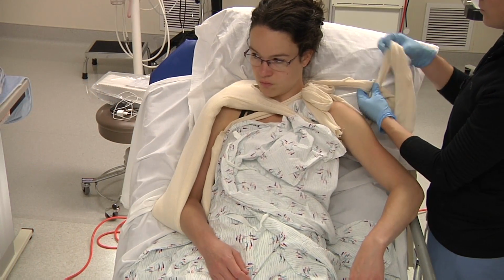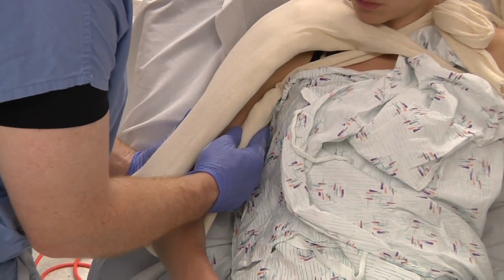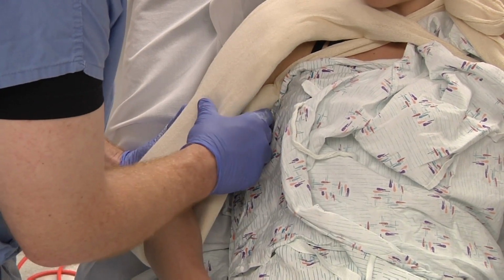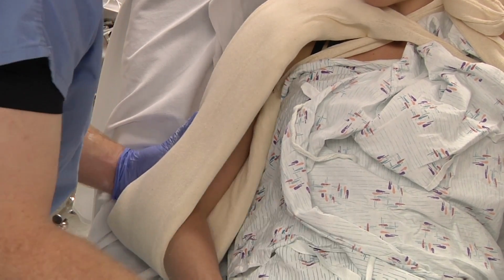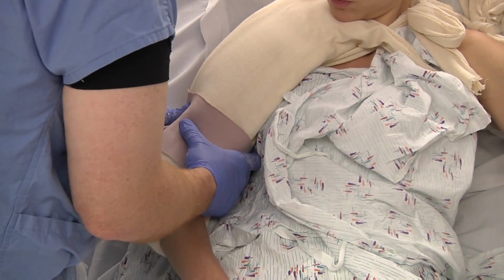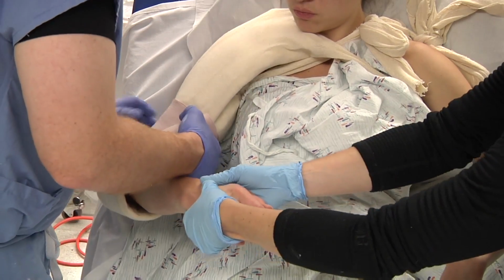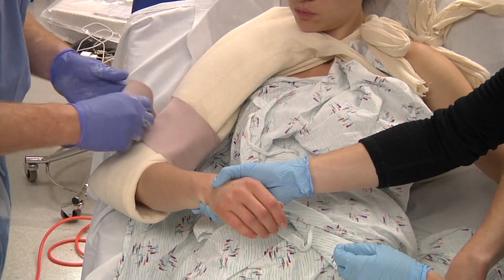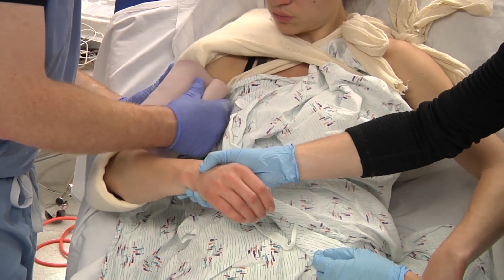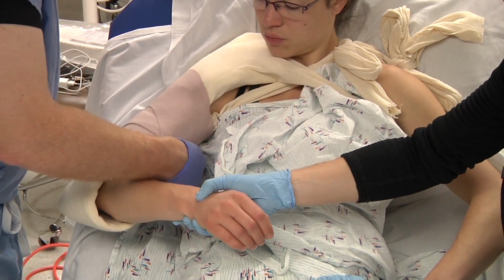From there, with the patient's arm cradled, make sure that there is no sharp padding or sharp plaster in the patient's axilla and that it's well padded. The plaster extends high enough. Like to wrap an ace wrap around. Dr. Thayer, if you can hold that. Thank you. We're wrapping an ace wrap around to hold this in place, remembering to keep it on the lateral aspect of the humerus, keeping it from going anterior.